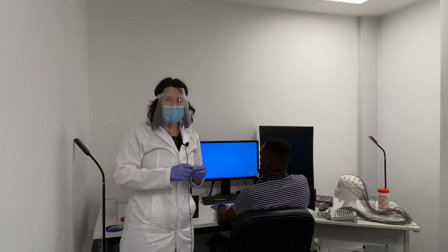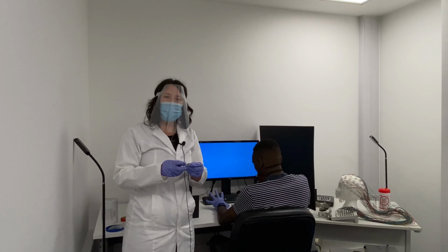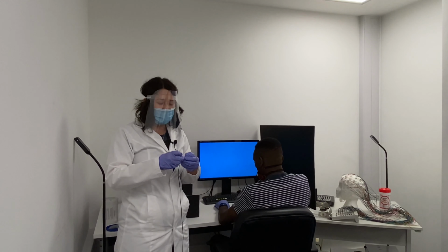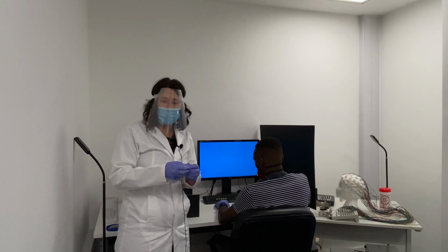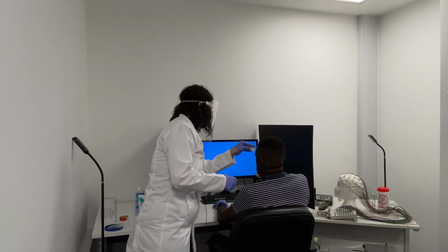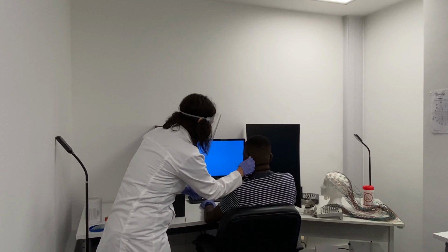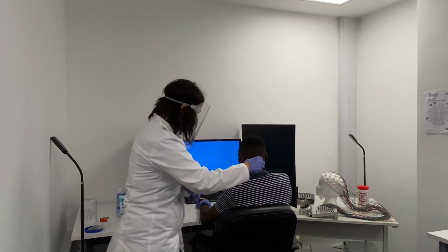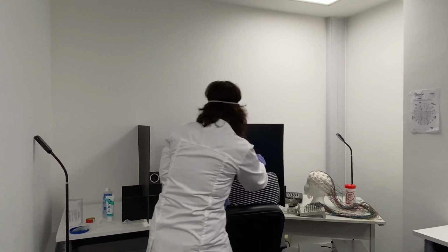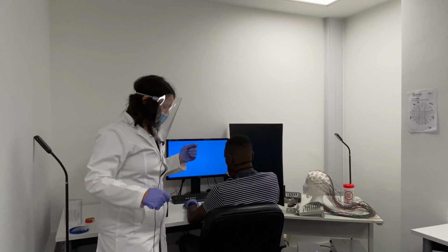Before I can set up the cap, I need to prepare his skin, because skin in general produces a lot of grease to protect itself, which will increase the impedance, and then we cannot get a clear signal from our electrodes. Now I can set up the cap.